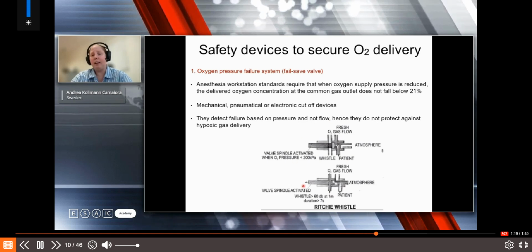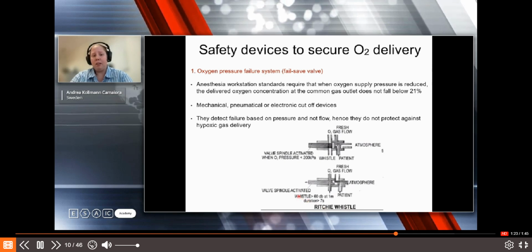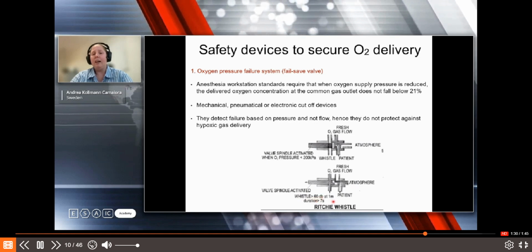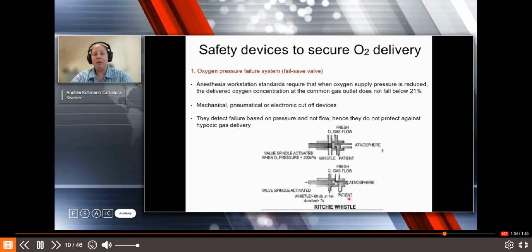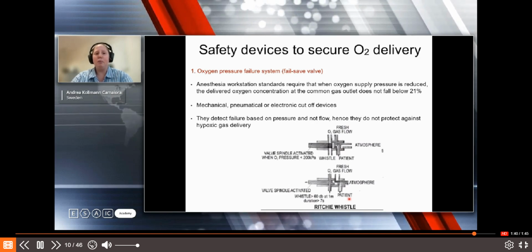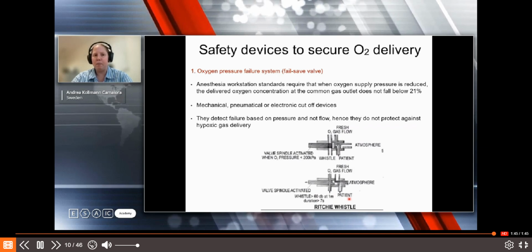And in the exam, if they ask you about the Ritchie whistle, then you need to answer that it's over 7 seconds at over 60 decibels at 1 meter from the patient. So if you hear this very loud peep that lasts longer than 7 seconds at a close distance to the patient, it's most probably the Ritchie whistle and is the fail-safe valve.